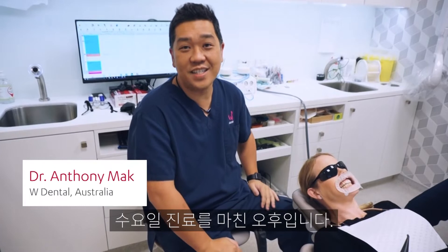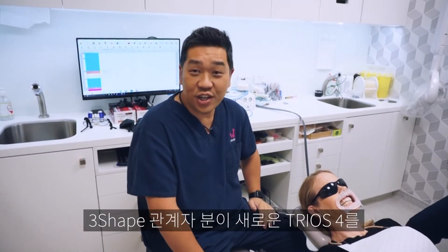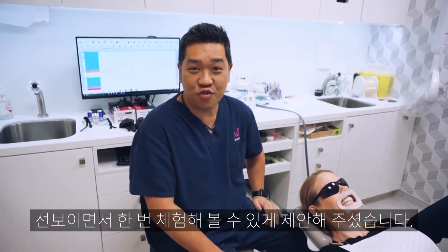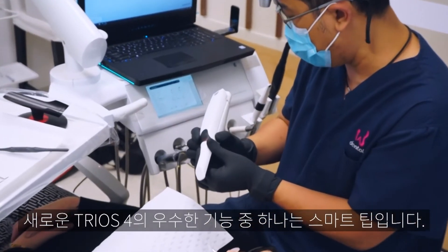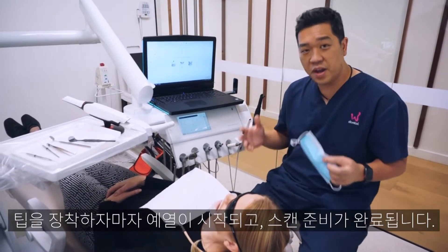We're here after work on a Wednesday — dentistry never stops. Three Shape decided to pop in and bring in the new Trios 4 for me to try. One of the cool features of the new Trios 4 is the tip: basically as soon as you put the tip in, it's really warm and it's ready to go.